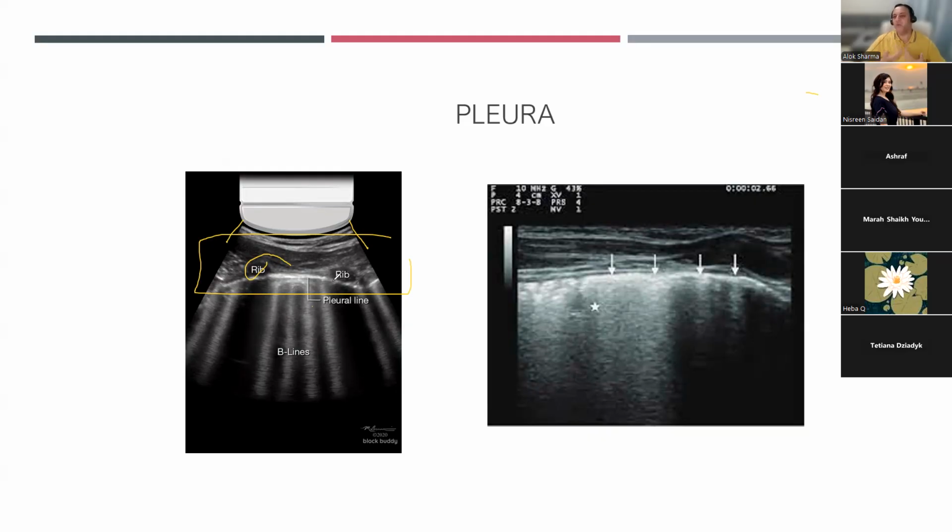Now, we divide the lung into upper and lower regions based on a line that travels through the nipples. So if you have 12 ribs, you're really talking about three images anteriorly, three images laterally, and three images posteriorly. With an extended view, you can get the whole lung in. In the Philips Sonosite and in the GE, you've got an extended view, which means I can literally use one footprint to see the entire lung in the majority of babies.